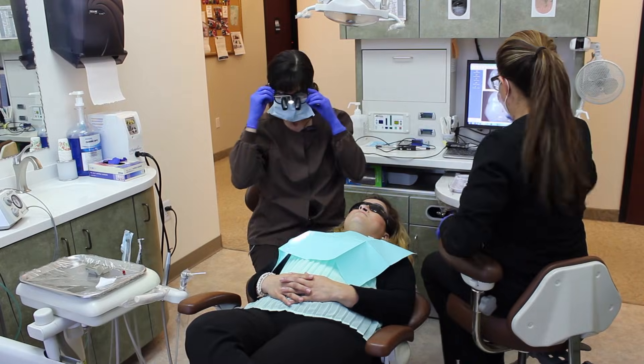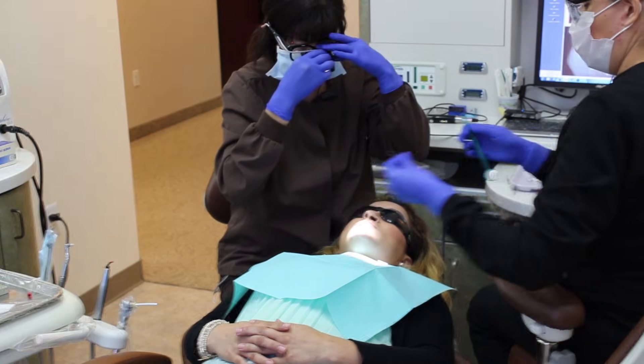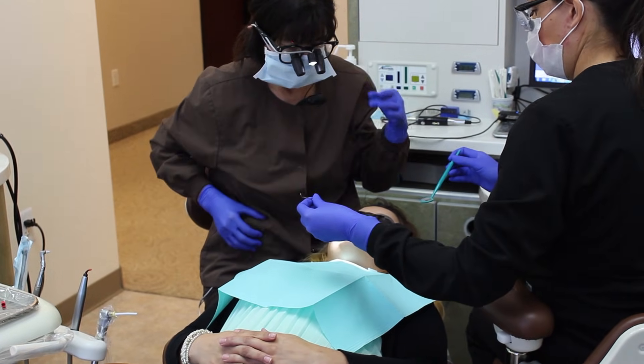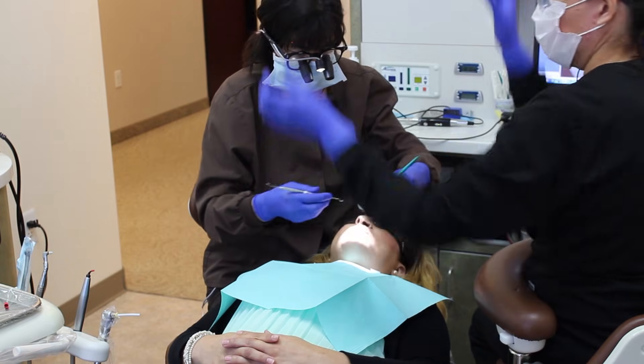Let me have the mirror and the explorer first.